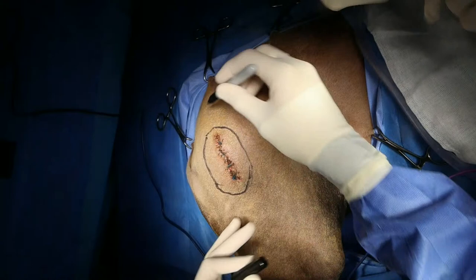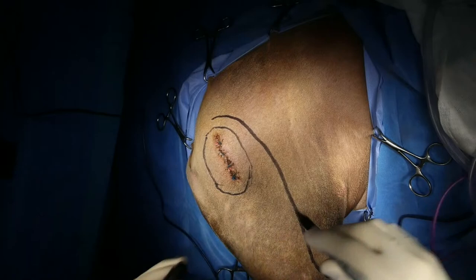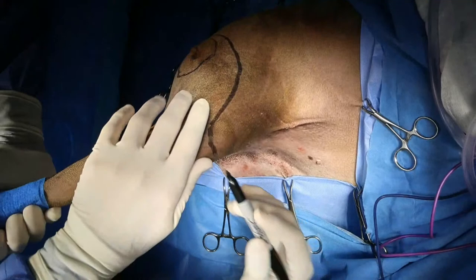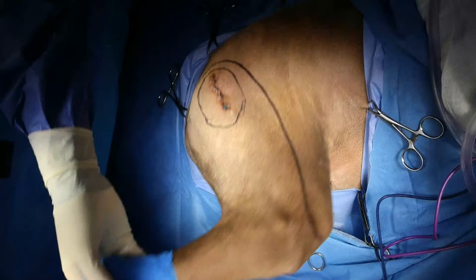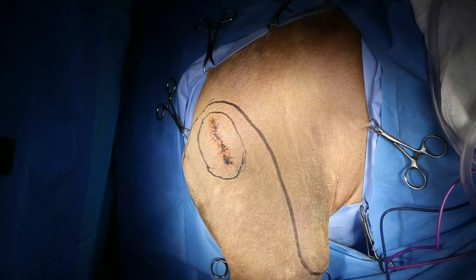Now, the location of the biopsy incision is going to make it challenging to excise the biopsy incision and close the wound. So what we're going to do is I'm going to harvest a flank fold flap before we amputate the leg, because we can take as much flank fold flap as we want. So I'm going to harvest a bunch of skin from my flank fold flap and then come down around the side here, up around over here. And so that flank fold flap is just going to serve as our skin flap for closure. And I have found that to be very effective in managing the skin defect that forms when you have to remove a biopsy tract. So go ahead and start my incision here.